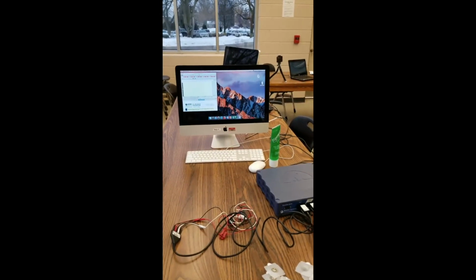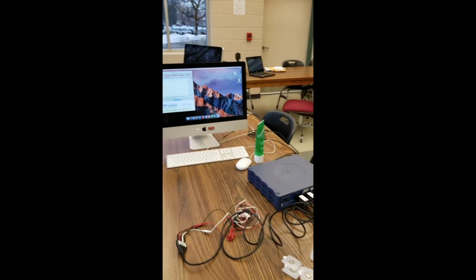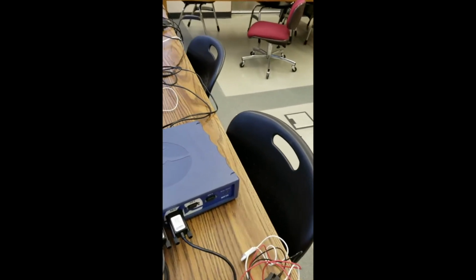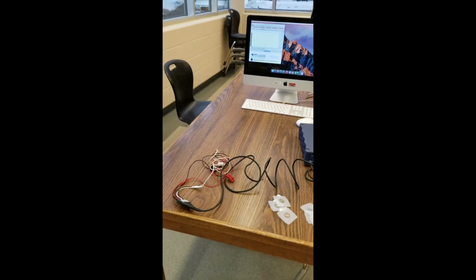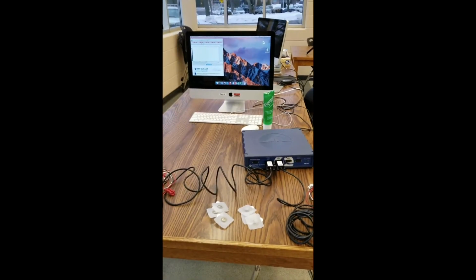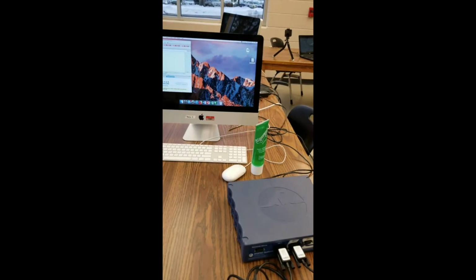Now, when we look at electromyography, we're actually looking at the electrical activity in a muscle because muscles are excitable tissue. Now, to get that electrical activity, we have to use electrodes. So we're going to use the BioPack, and you can see that we have set up basically 2 sets of electrodes. Each set of electrodes will measure the electrical activity or the EMG activity from one muscle. We're going to do the quadriceps and the hamstrings today. And a little bit later on, you're going to see the setup on the leg, how we actually put those electrodes, which you see right here, on the leg, and then clip to them to actually measure.